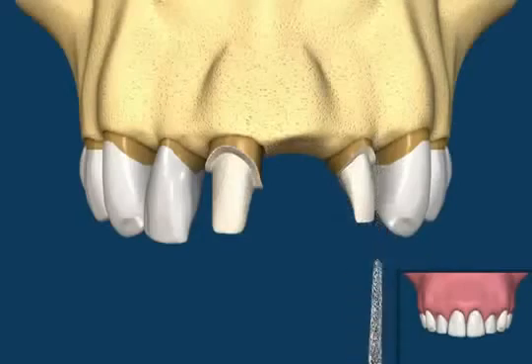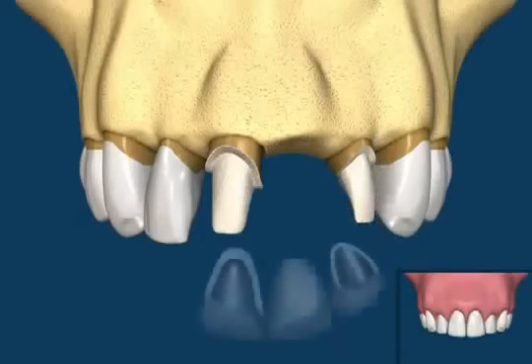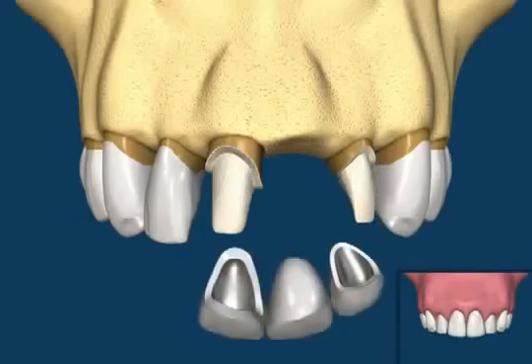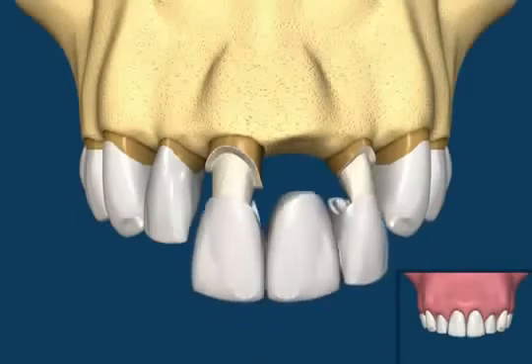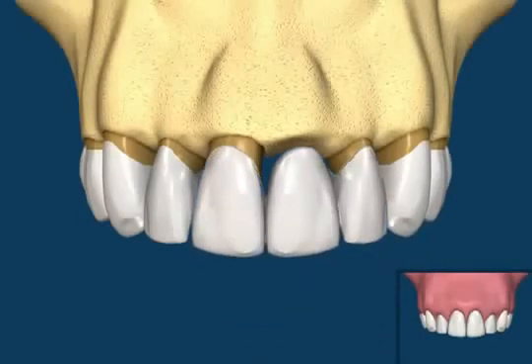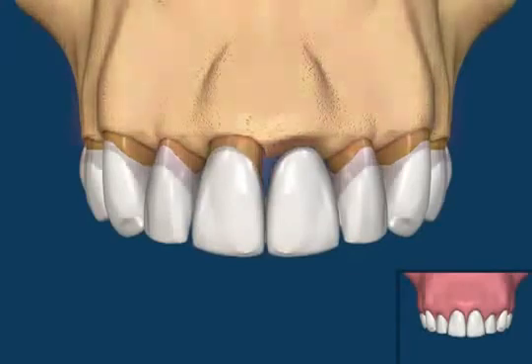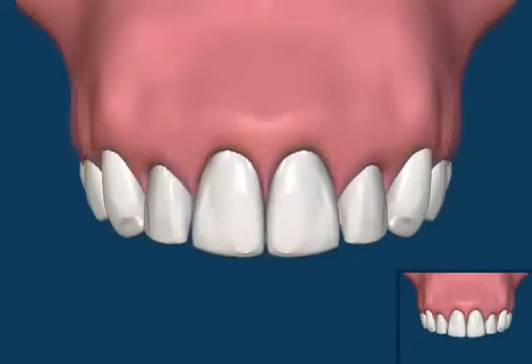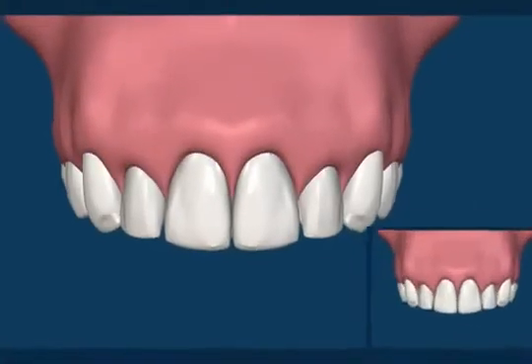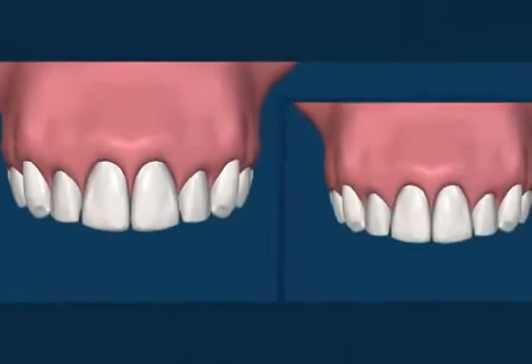A bridge, which is basically two crowns with a tooth in the middle, is cemented on top of these prepared teeth. Comparing the two situations at the early stages of post-treatment shows that they can have similar cosmetic results.